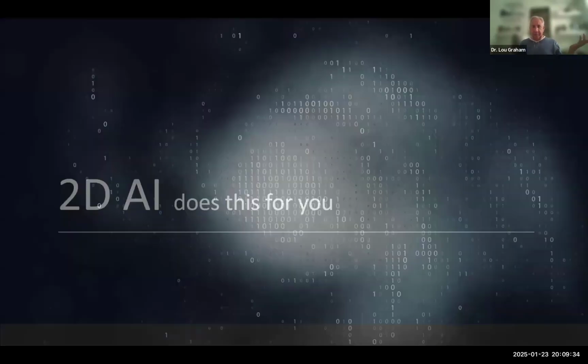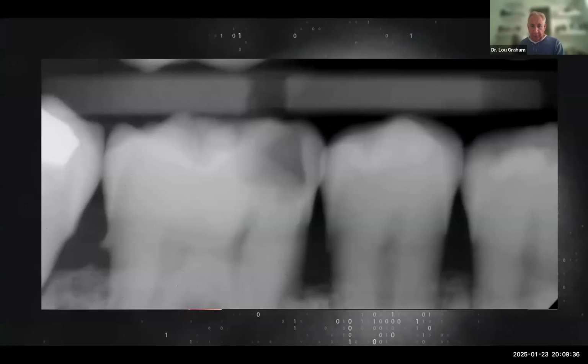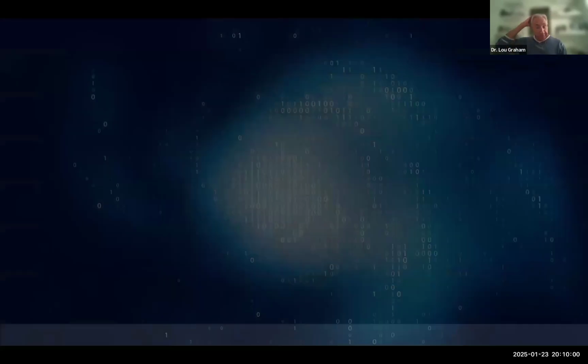2D AI now does the measuring for you. So here's another patient with deep caries, and you can see that mesial pulp horn has not receded. So those tubules are going to be more open. You know you're going to have more penetration with your SDF because that healthy dentin is going to have wider open tubules because there's been no time for that pulp horn to recede and lay tertiary dentin down.